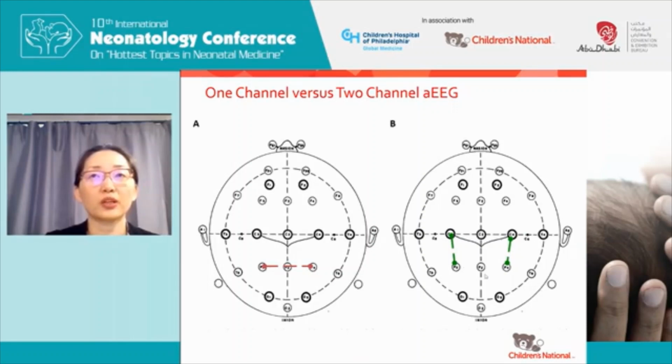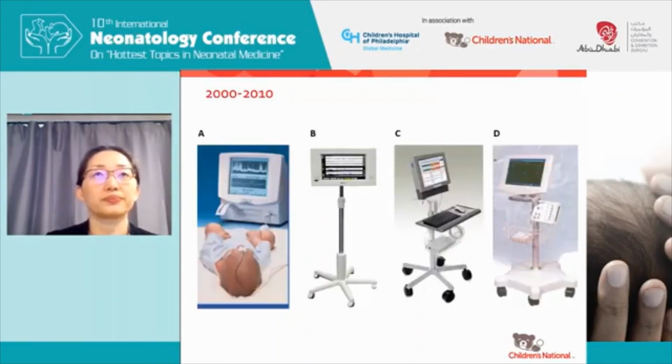And by having 4 electrodes or 2 channels, not only does it give you more geographic coverage of the cerebral cortex, it also allows you to discern the difference between right or left when you have unilateral injury, which is more likely to occur in an ECMO patient.